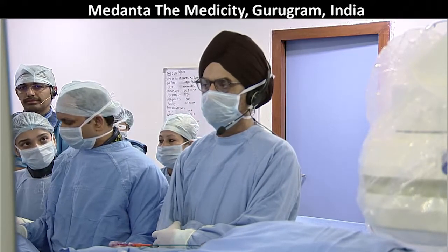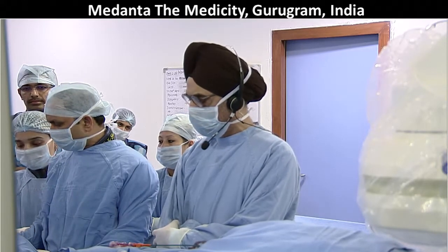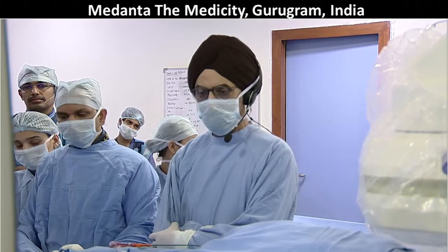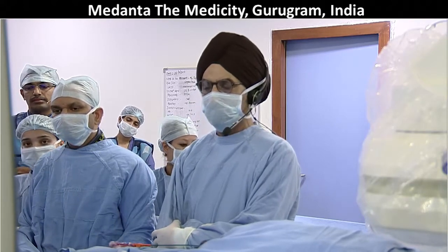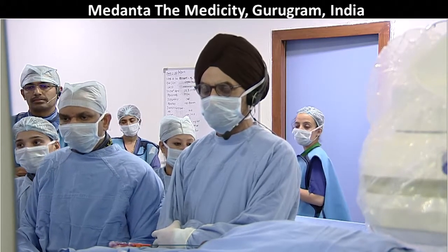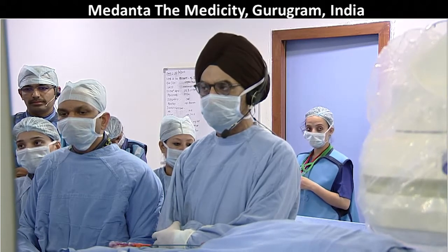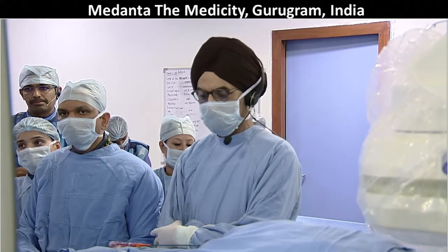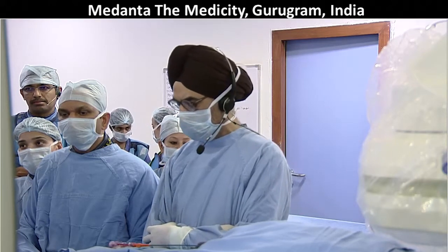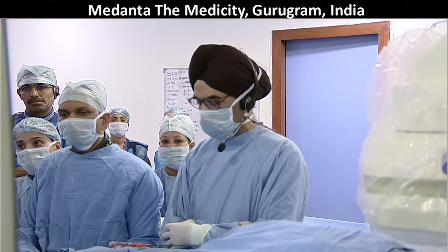Yeah, I think the right coronary artery has been addressed successfully, and the circ is normal. So what I see here is probably a significant lesion in the proximal LAD, and there is also a lesion in the mid LAD. I think we can do IVUS, and then we may have to fix the lesion in the mid LAD and also the proximal LAD, depending on the IVUS findings.